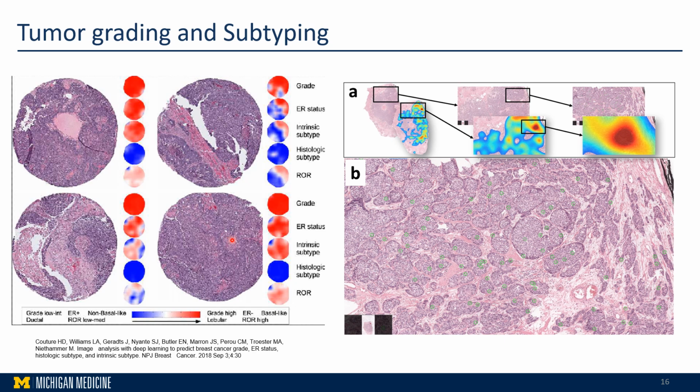So as you see, automated mitosis quantification is also important for reviewing breast tumors and other cancers that require mitosis scoring. Consequently, this may enable a new scoring paradigm in the digital era that might replace high power magnification.